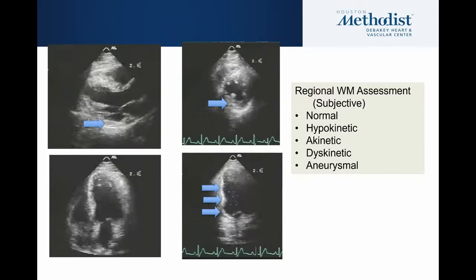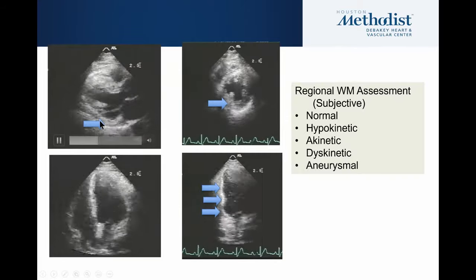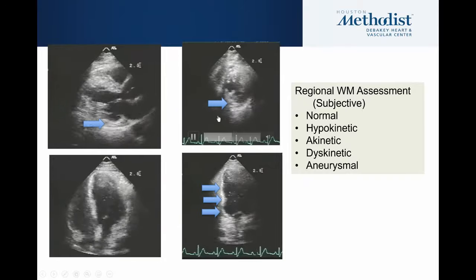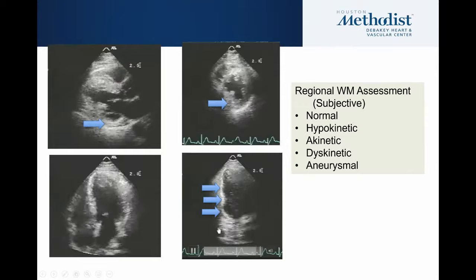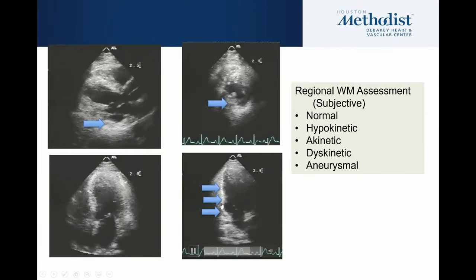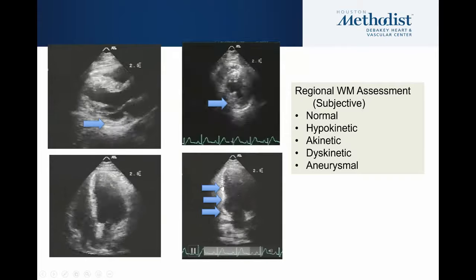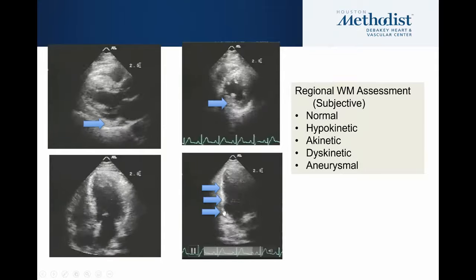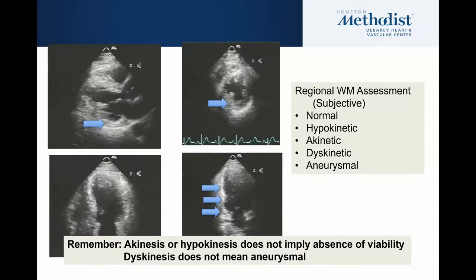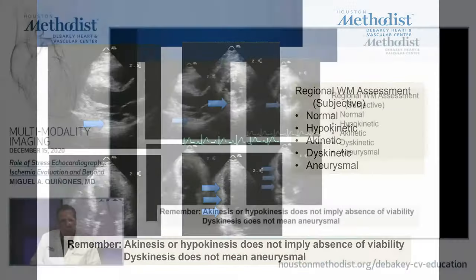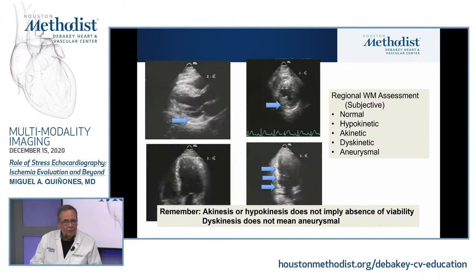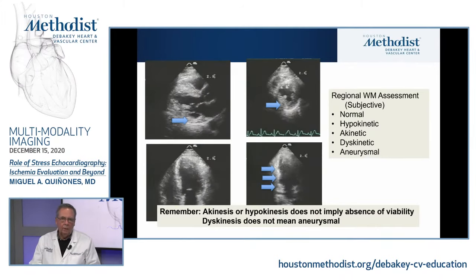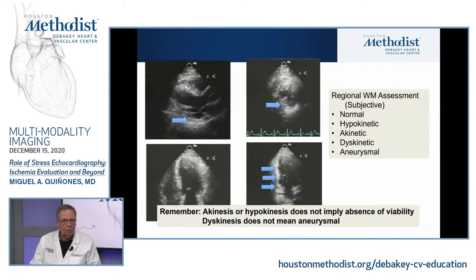In the parasternal long axis view, the inferolateral wall has some hypokinesis compared to a normal septum. More closely to akinesis — no thickening at all — in those segments in the four-chamber view, and in the two-chamber view there's even a little dyskinesis, at least definite akinesis from the base to the mid segment. Two important points: presence of akinesis or hypokinesis does not imply absence of viability, and dyskinesis is not the same as aneurysm — an aneurysm requires geometric distortion in diastole.